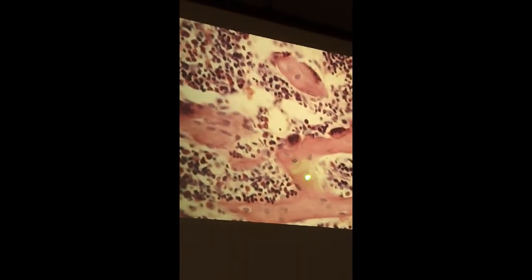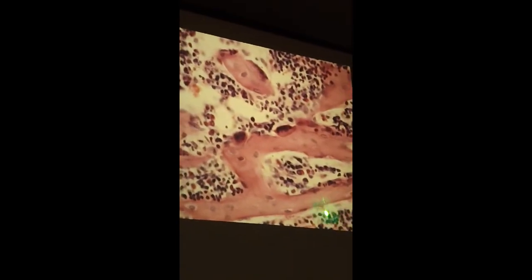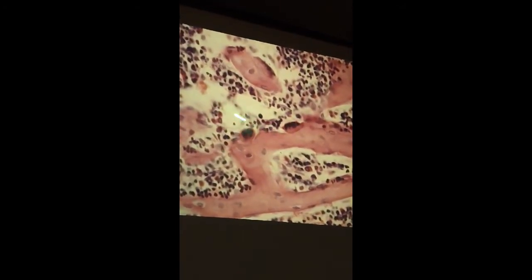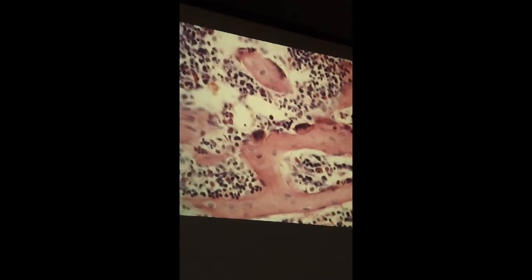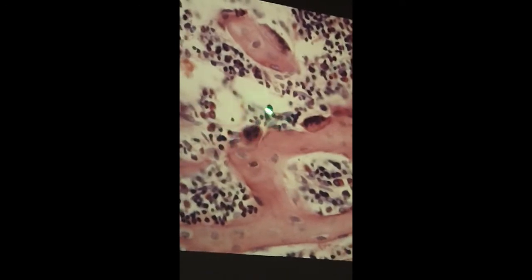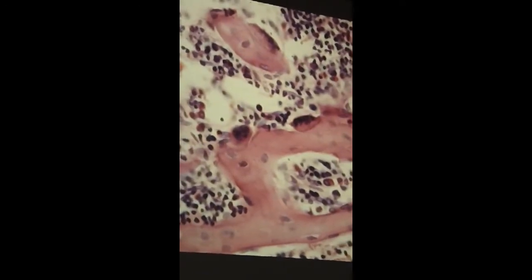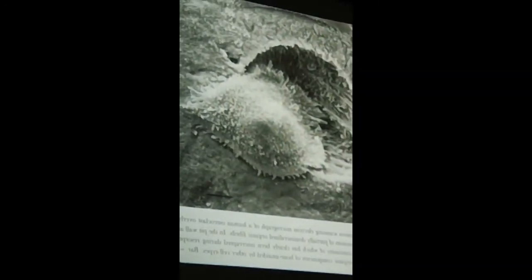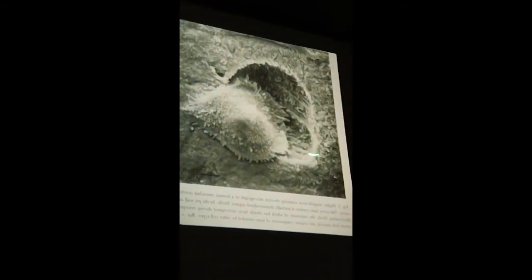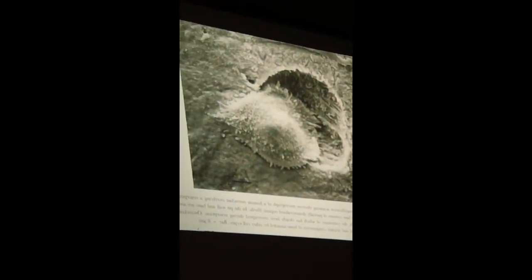So we've got some spongy or trabecular bone right here. We've got nice osteocytes. Not a lot of surface activity, or it's been pulled away, except for, look at that, right here. And even at this power, you can get a sense that there's more than one nucleus there. And you can get a sense of this resorption bay or Howship's lacuna, this scalloping out that's done. And then one of my favorite micrographs of all time, worth seeing again, is this osteoclast that Nigel showed you in lecture that has been flopped out.